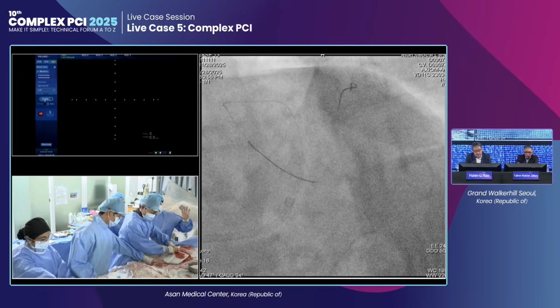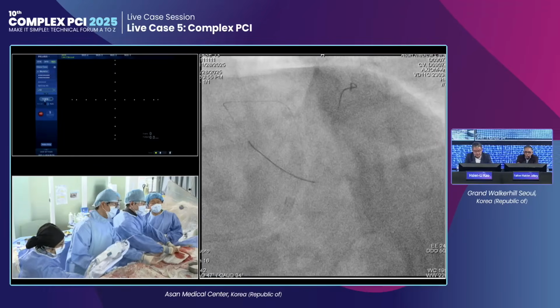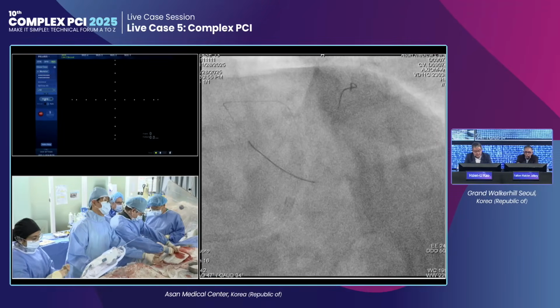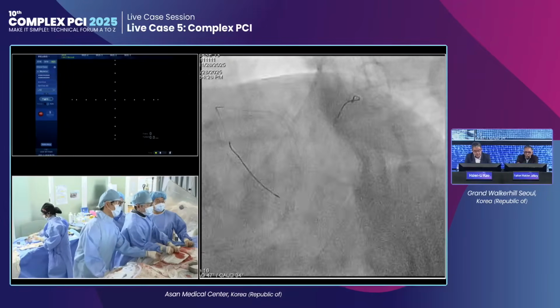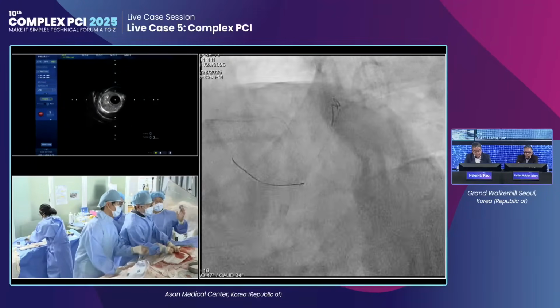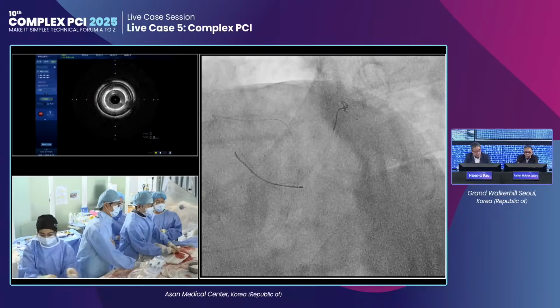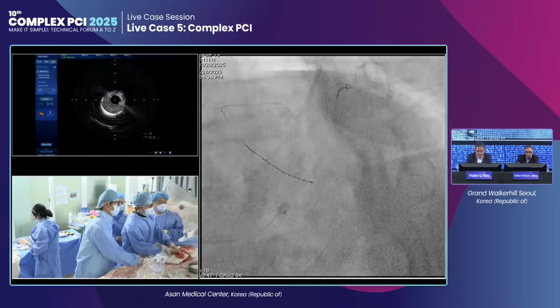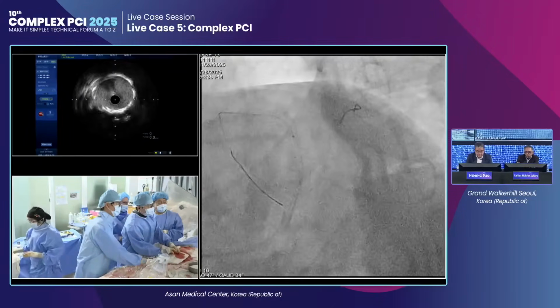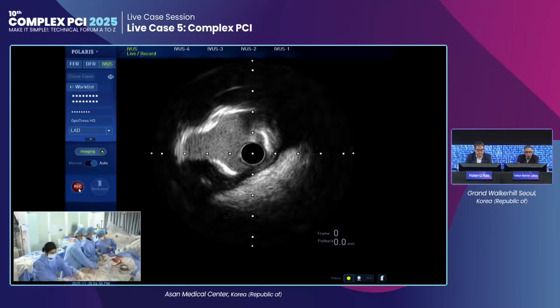At the beginning, I think doing an IVUS from here is not hurting. You do an IVUS, maybe you will show that the stent ends right distal to the circumflex ostium, and what we are seeing from the angiogram is actually just a hallucination. Then we don't do anything. Well, but if you have physiology, it's unequivocal that flow is not limited, right? So I think that information is quite valuable.